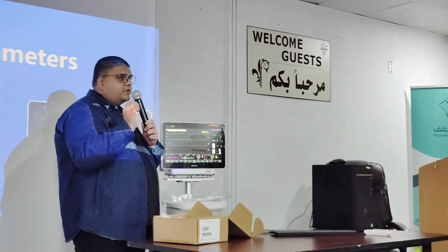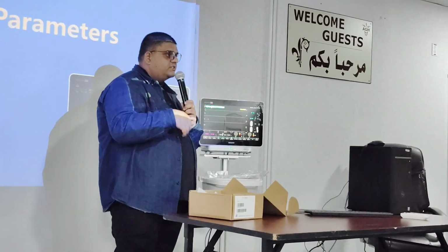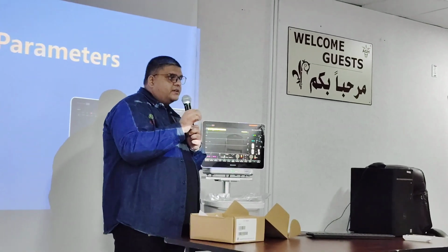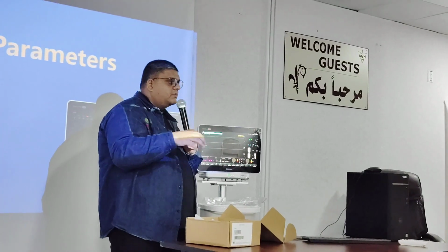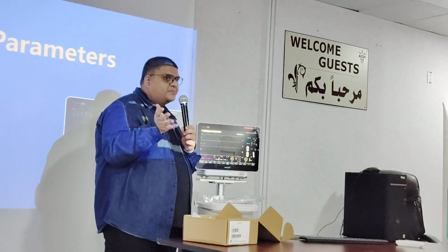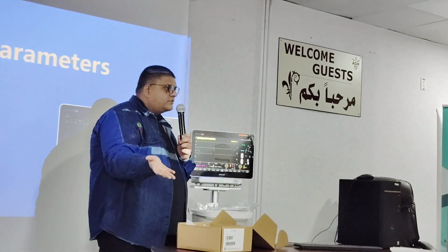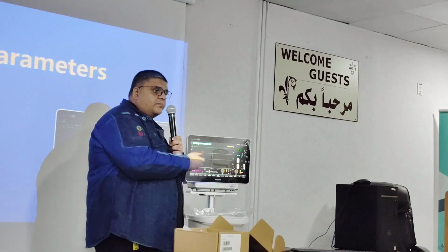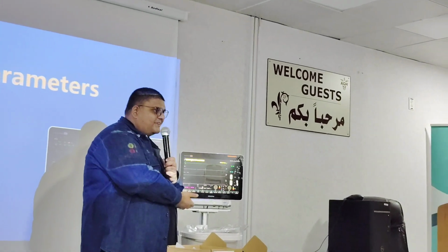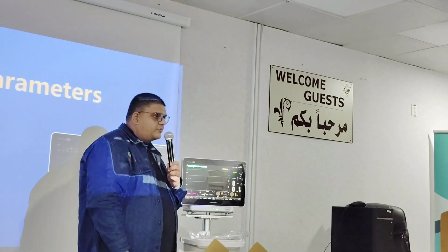Why? Well, first is because the algorithms that we have, like for SpO2 or ECG, are more suitable to the patient's age. You know the arrhythmia, let's say a simple arrhythmia like tachycardia. Tachycardia in an adult patient should be heart rhythm above 120 or something, right? Above that would be tachycardia. But in a neonate, the normal heart rate is 150. So how would that be normal? So your monitor keeps giving you alarms, and you're like, why is this monitor giving me so many alarms, right?